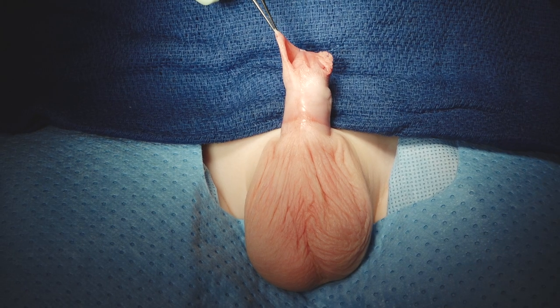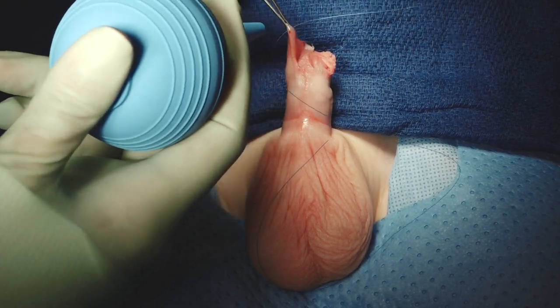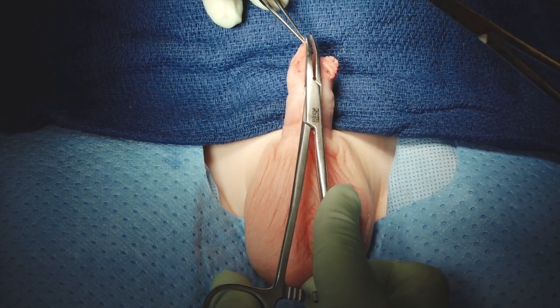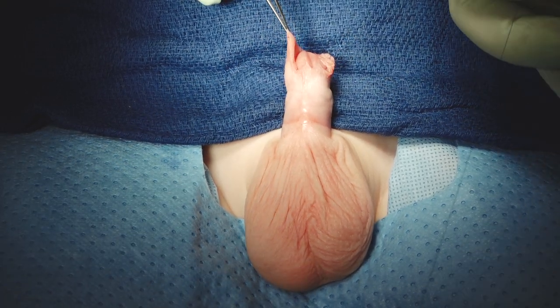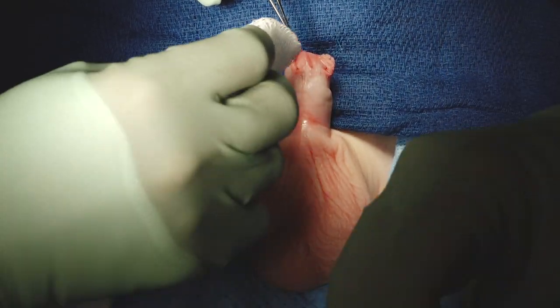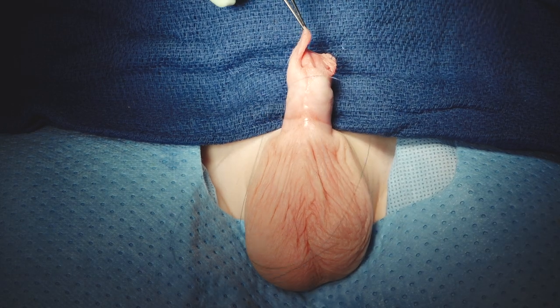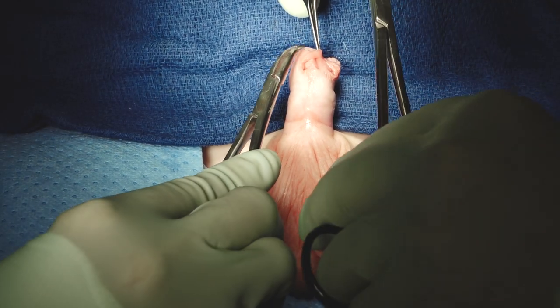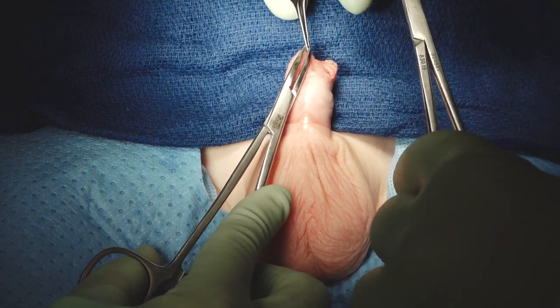Let's talk about that for a second — we're putting in stays in the corners of the prep the way you would if you were doing a preputioplasty, in case we were to encounter 30 degrees of curvature or more. Today we're talking about this distal hypospadias repair. We have learned that the number of boys with distal hypospadias who have curvature of 30 degrees or greater is actually about a third of them.